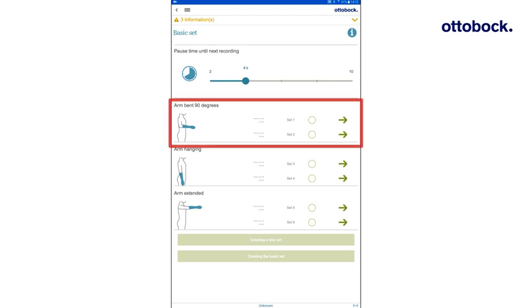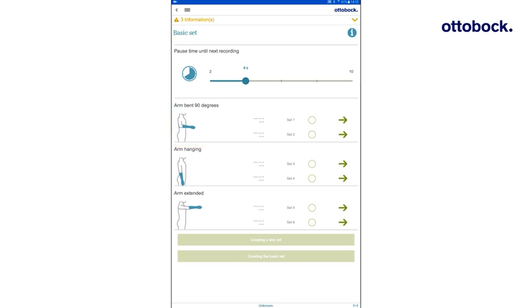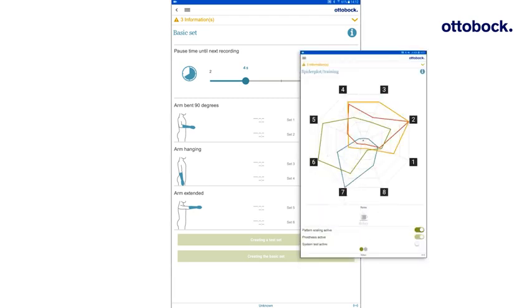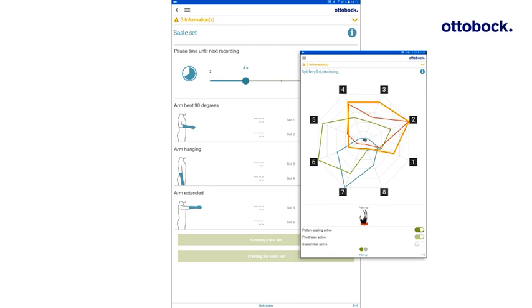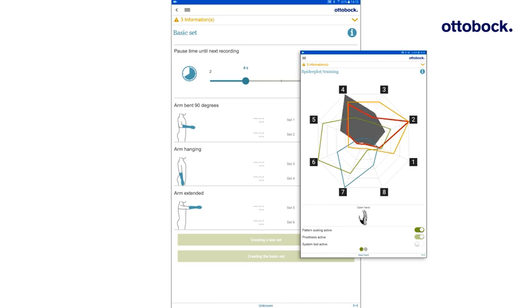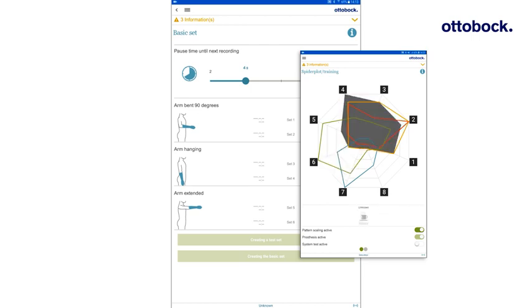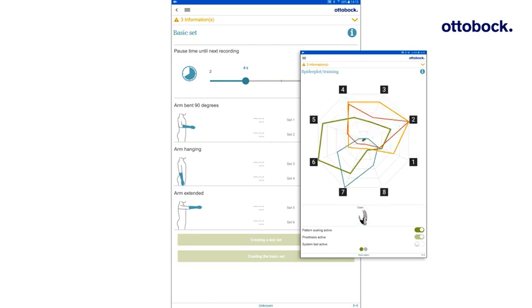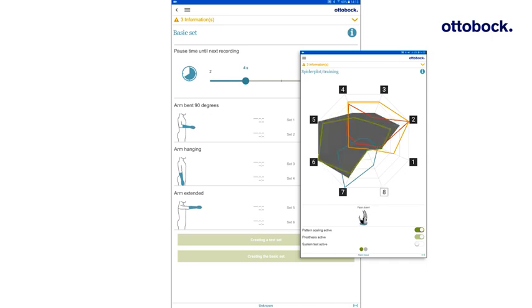With the MyoCuff, it is advisable to record a test set, which consists of just two recordings in the 90 degree bent arm position. After recording the test set, the shape of the recorded patterns will be displayed in color in the spider plot. And the prosthesis movements can be simulated and tested. If the patterns are separable, they can be used for the basic set of the interims or definitive prosthesis. If they are not separable, alternative phantom hand movements need to be identified and a new test set has to be recorded.